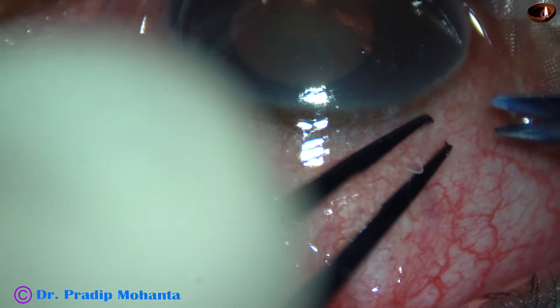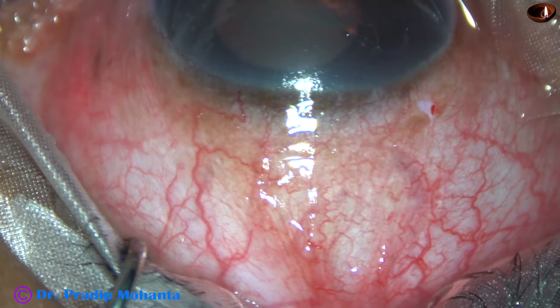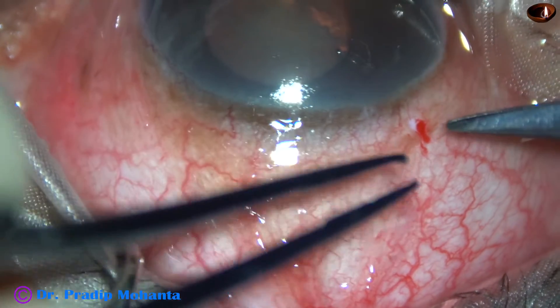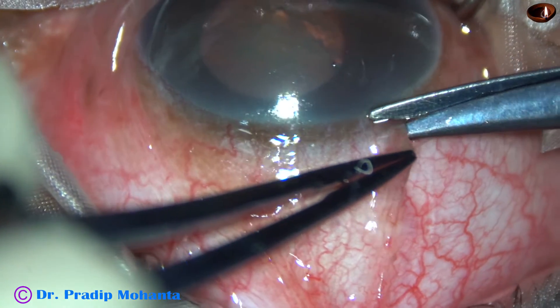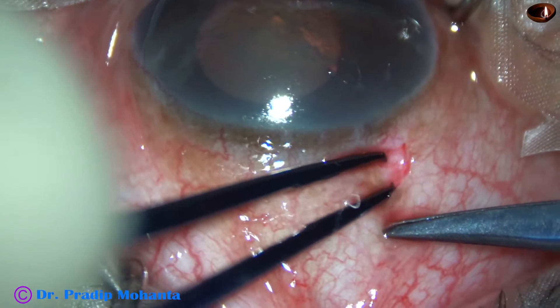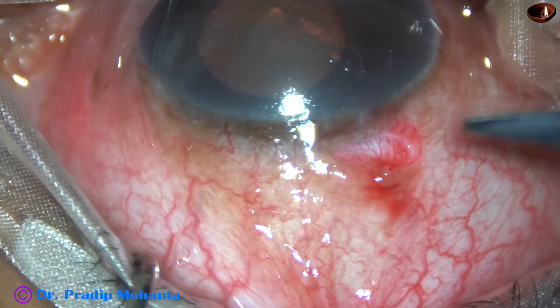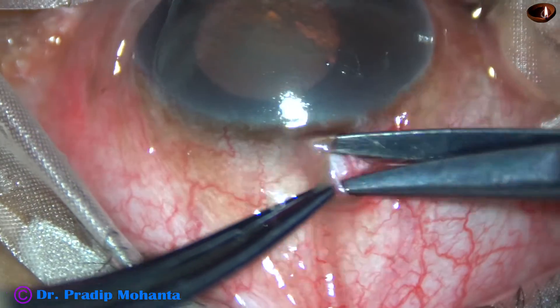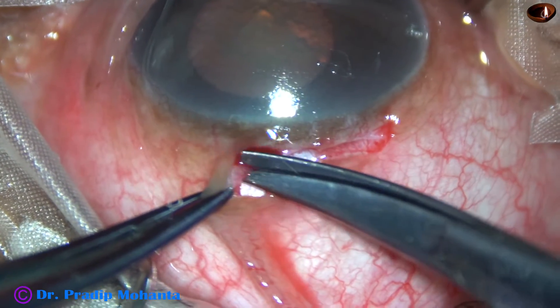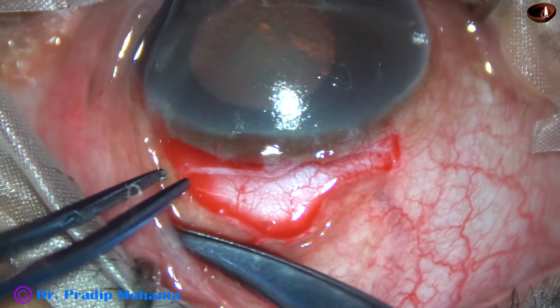After a superior rectus bridal suture, conjunctival peritomy is done for about one and a half clock hours. This is a small radial cut. Now I take a Vannas scissor and a forceps. There is thick Tenon's tissue underneath, so I have to incise the Tenon's. Now I am taking conjunctiva and Tenon's together and exposing the sclera. The peritomy is from 11 o'clock to 12:30 o'clock.